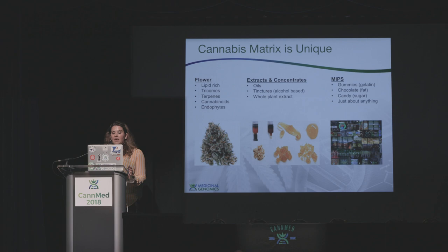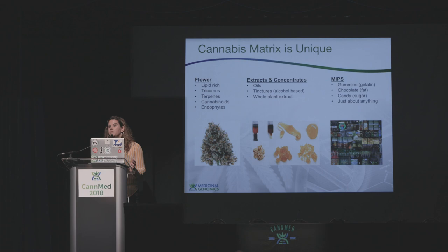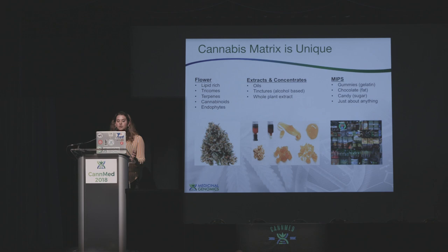And this isn't good for culture-based methods because the detergent can also break down the cell wall of the microorganisms that you're looking at and therefore render them not viable to be growing on your media. So while these quick aqueous preps are good for quick turnaround time and not having to extract DNA, they really put you at a disadvantage of sampling what you're truly looking at. And some other people before me have talked about how the cannabis matrix is very hydrophobic.